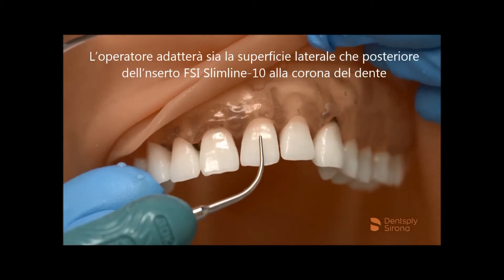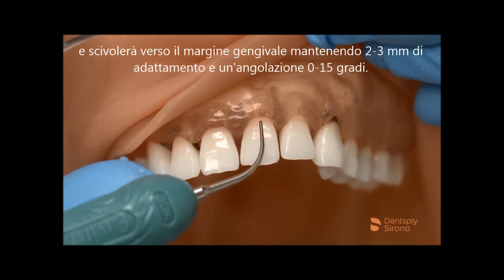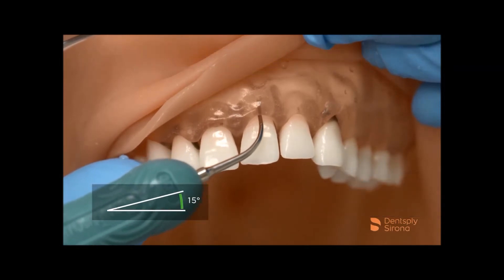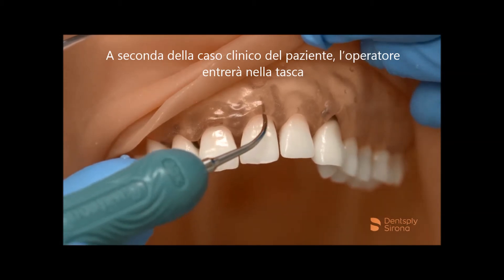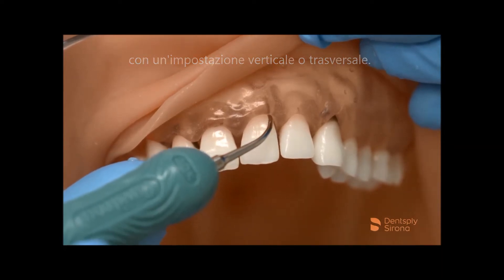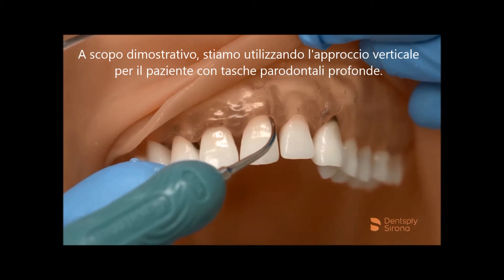The clinician will adapt either the lateral or back surface of the Cavitron FSI Slimline 10 to the clinical crown and float towards the gingival margin, maintaining 2-3 mm of adaptation and a 0-15 degree angulation. Depending on the patient presentation, the clinician will enter the sulcus or pocket in either a vertical or transverse approach. For demonstration purposes, we are utilizing the vertical approach for the patient with deeper periodontal pockets.